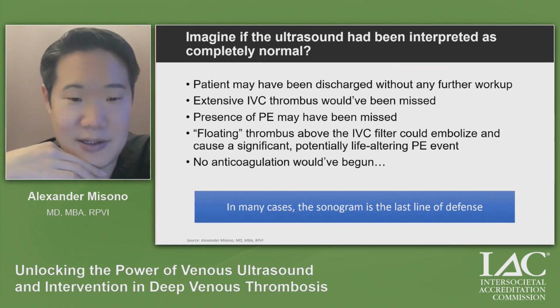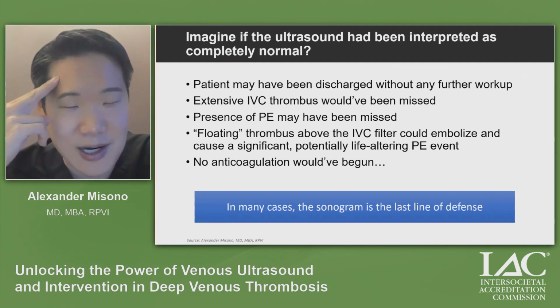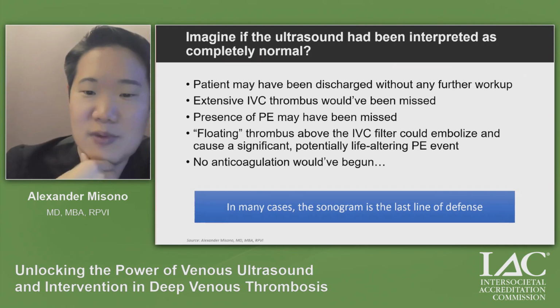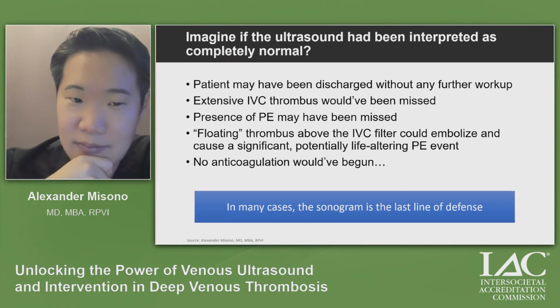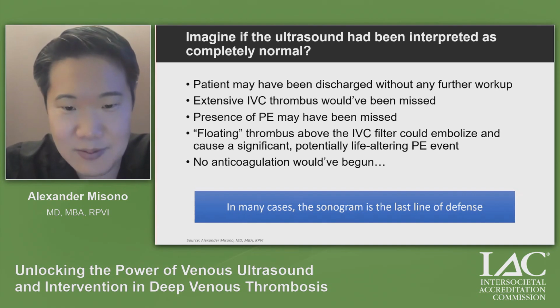If we had missed the fact that there was a subtle difference in the waveforms and at least asked, why is it a little bit different? Doesn't look quite right. Then this patient may have been discharged without any further workup. Their IVC thrombus could have been missed. Their diagnosis of PE may have also been missed.